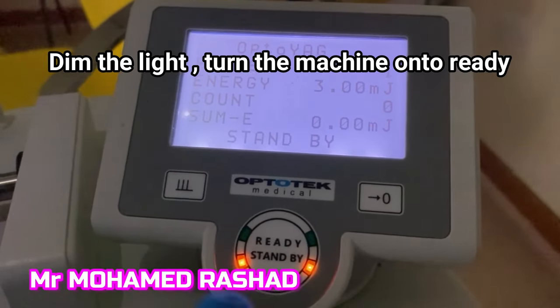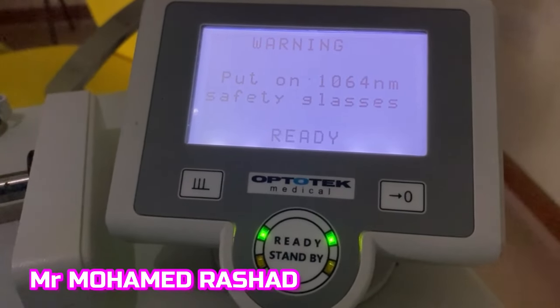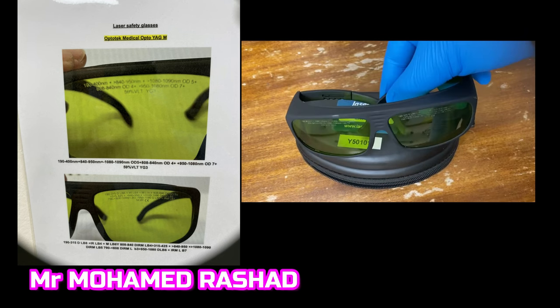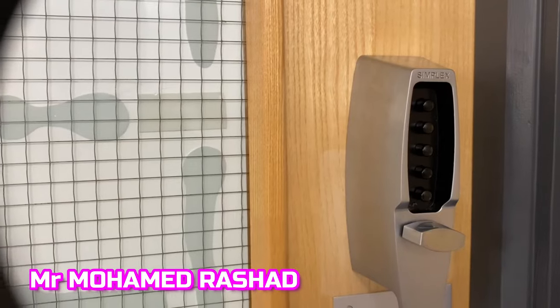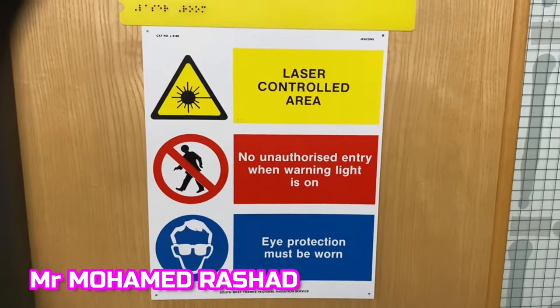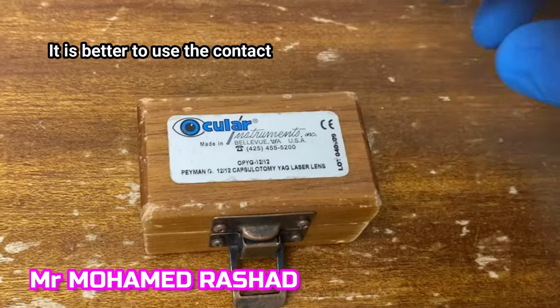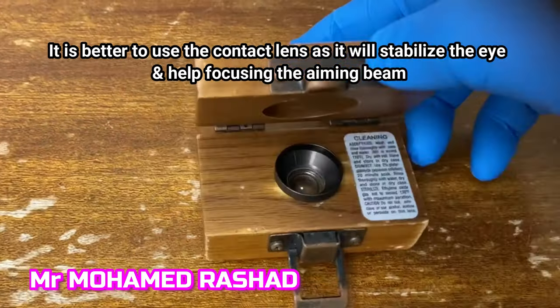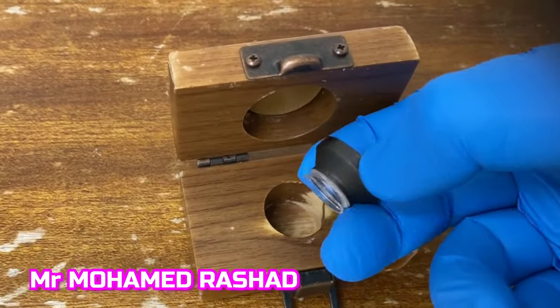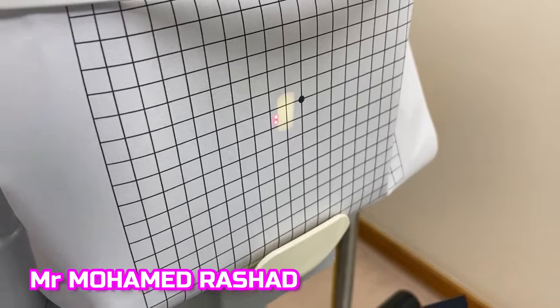When the slit is oblique the laser is working. Bring the patient, dim the lights, and turn the machine into ready mode. Use the correct safety goggles, close the room, make sure there are no windows open, know about laser safety, and turn on the laser warning sign. It is better to use a contact lens with a coupling eye gel — this will help in your first few cases. Then practice on Amsler grid paper on a tissue box.